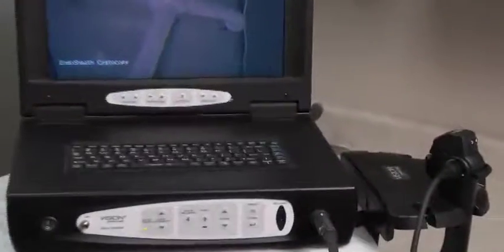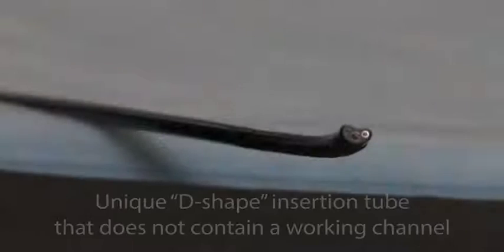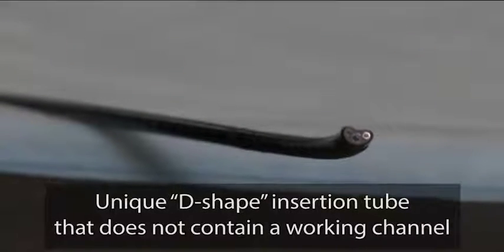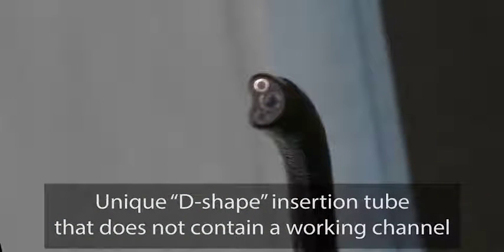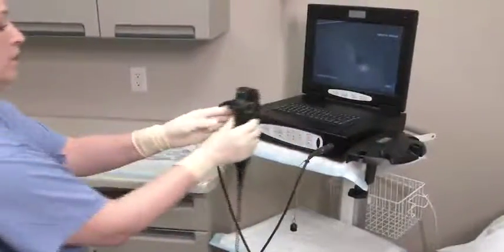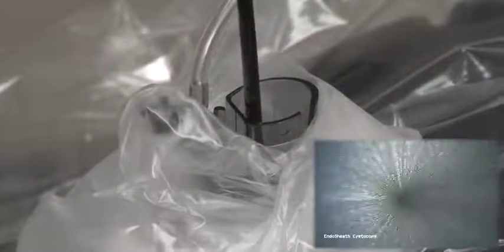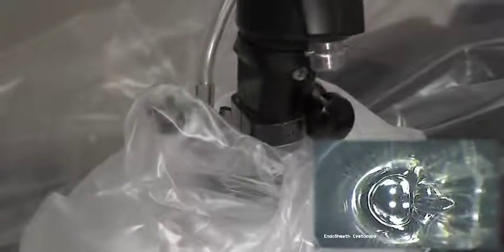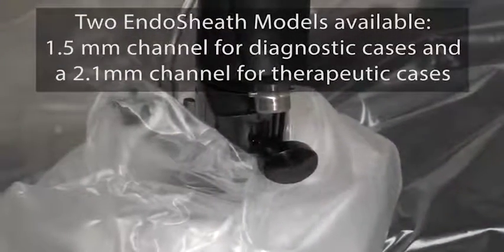The CST5000 Flexible Cystoscope contains image and illumination features like other cystoscopes, but unlike conventional scopes, the CST5000 has a unique D-shape insertion tube that does not contain a working channel. Instead, the CST5000 utilizes the patented Endosheath technology — a sterile, disposable sheath that fits snugly on the scope, providing a barrier between the endoscope and the patient. The sterile, disposable sheath also contains a 2.1 mm working channel for irrigation or accessory placement.